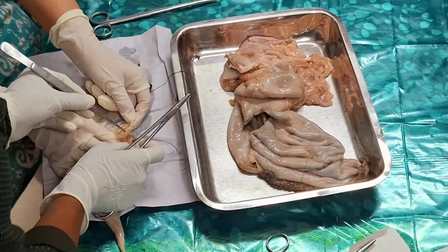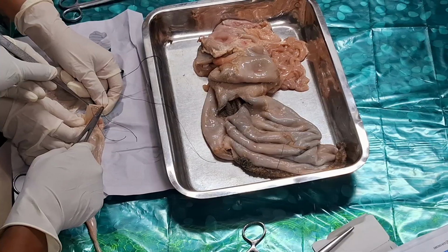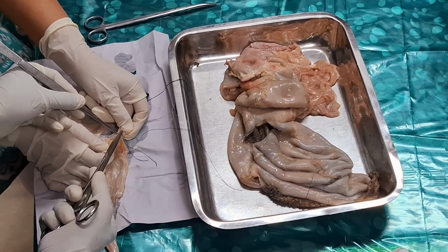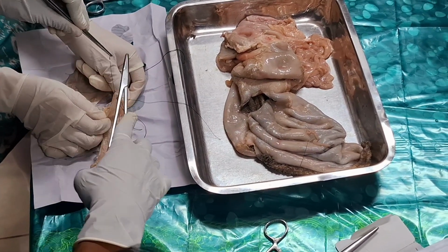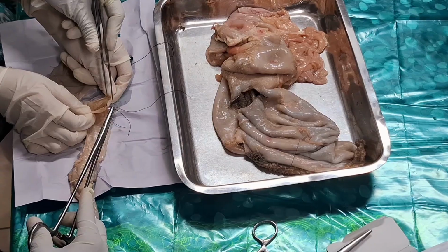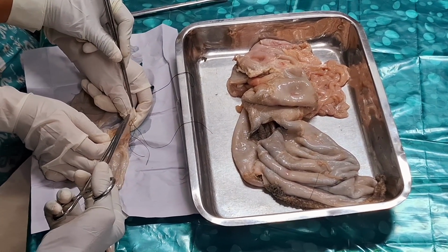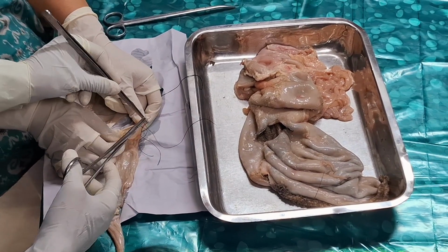Corner stitch, okay? You should start with a continuous stitch from the outer surface. Take a full thickness suture up to the mucosal surface. Then on the same side of the bowel, you should come out. First I went outside in, then you come inside out, at the same distance and depth, that is 3 to 5 mm.